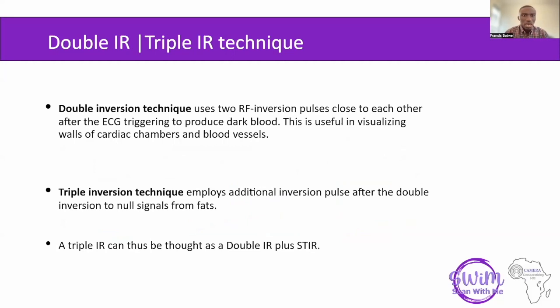So let's look at some types of inversion recovery techniques. We have double inversion recovery and triple inversion recovery techniques that we normally employ in cardiac imaging.